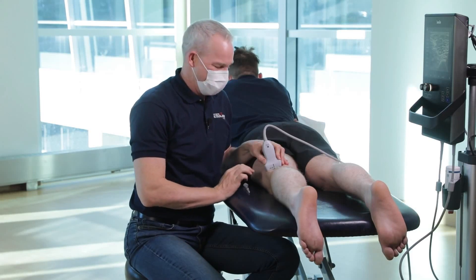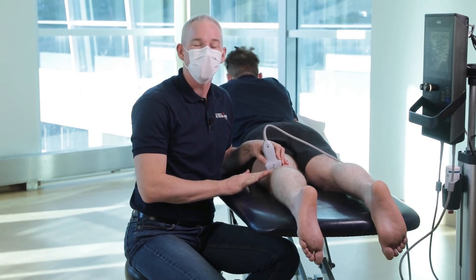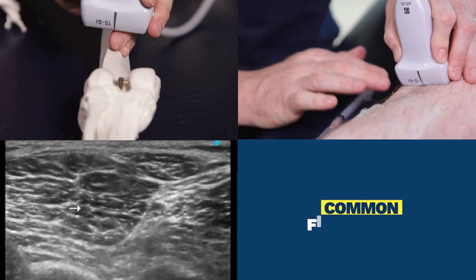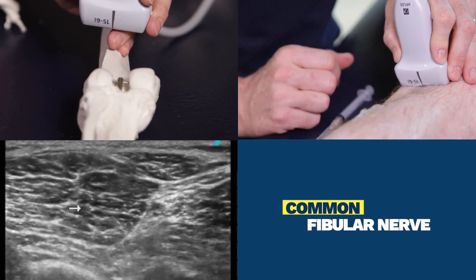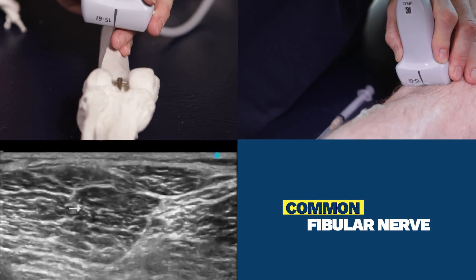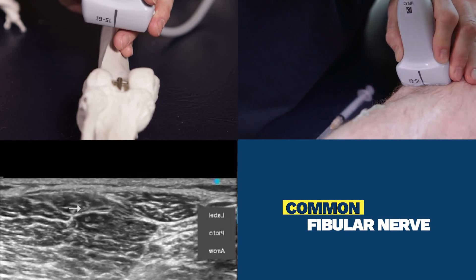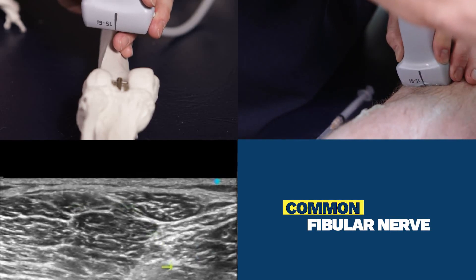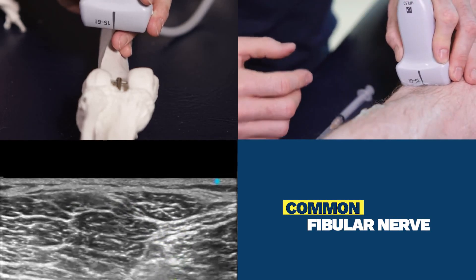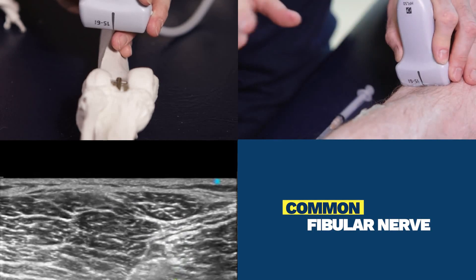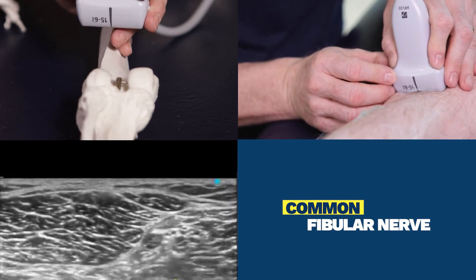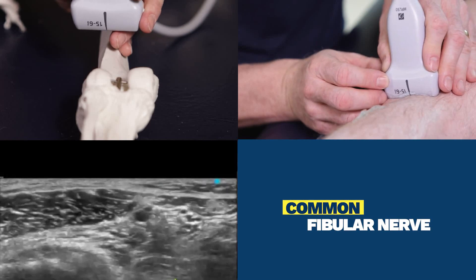I'm going to show you how to scan and inject the common fibular nerve at the fibular head. We start in the distal thigh. Our landmark is going to be the femur and we're cross-section on the femur — we see that in the bottom right-hand portion of the screen. I'm now going to reduce our depth and show you the sciatic nerve in this view. There's the sciatic nerve. I'm now going to scan distally until the sciatic nerve bifurcates into the tibial nerve and the common fibular nerve.